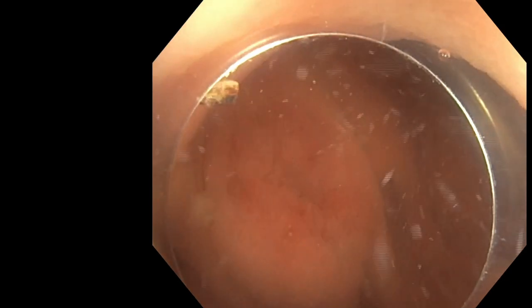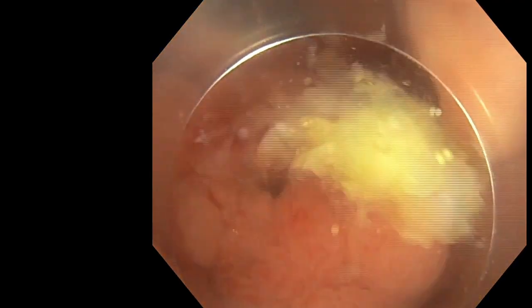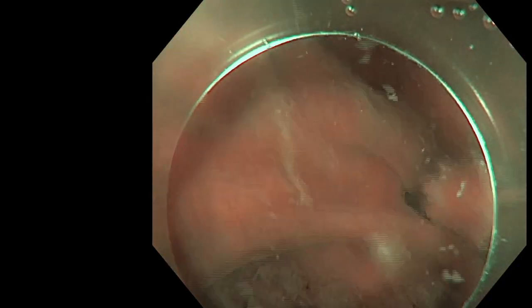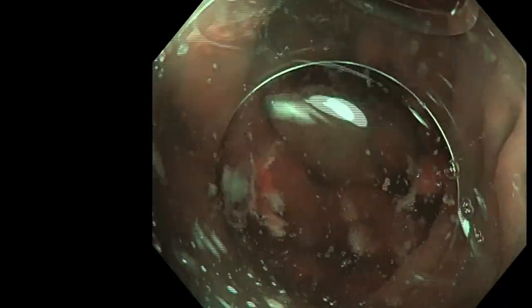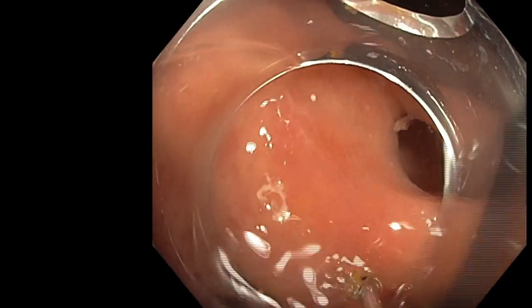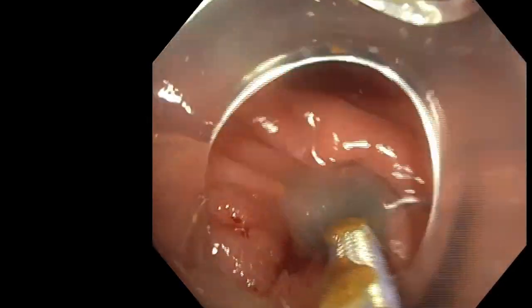Unfortunately, the bowel preparation was not perfect, so the image is not very clear at the beginning. You can see this lesion, which is somehow 15 millimeter, but really centered by a deep diverticula in the right colon in a patient with a lot of diverticulas, and one is really at the center of the lesion. We couldn't see any invasive pattern into the lesion, which was mostly irregular, and we could begin the resection.